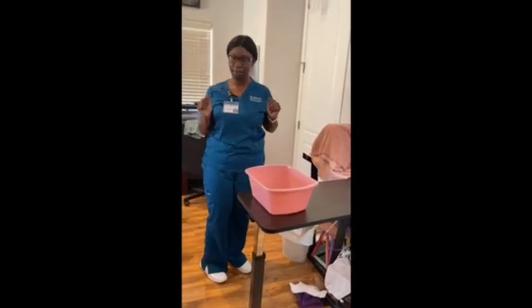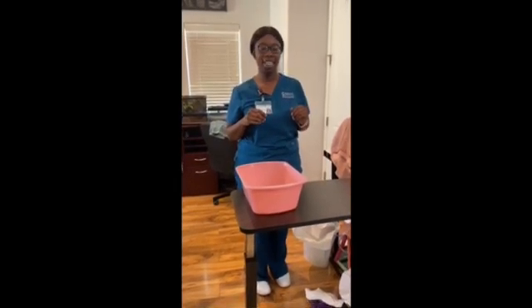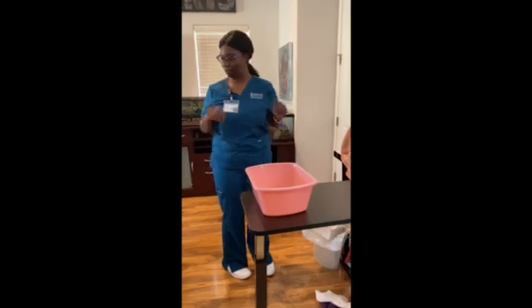And now I am going to document. 14 French indwelling Foley catheter inserted today at 0900. Pericare performed prior to start of the procedure. 10 ml of sterile water inflated into balloon. 650 ml clear yellow urine in drainage bag. Patient tolerated procedure. States, "I feel better." Okay. At this time, I will continue straightening up the room completely.